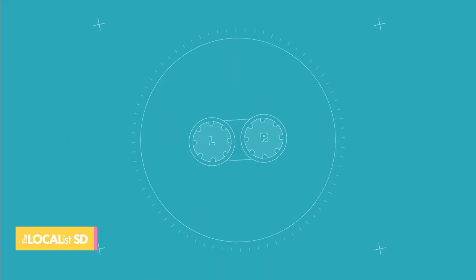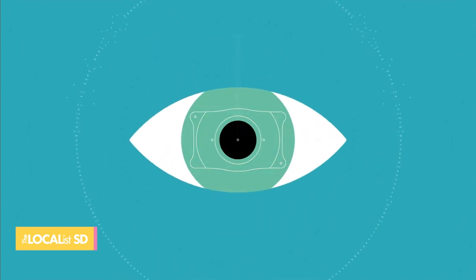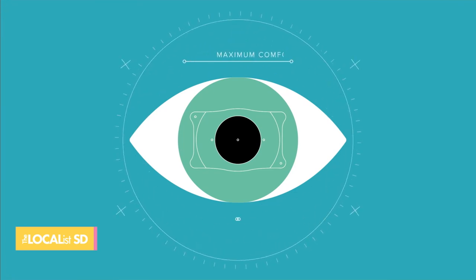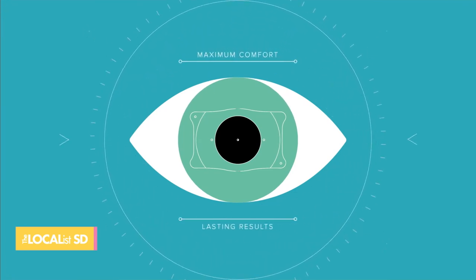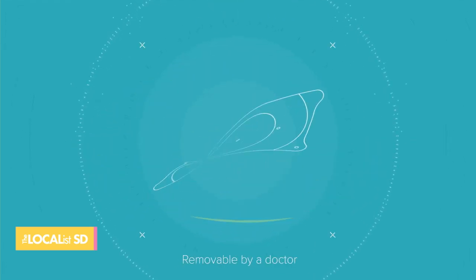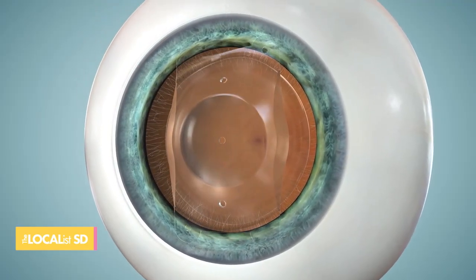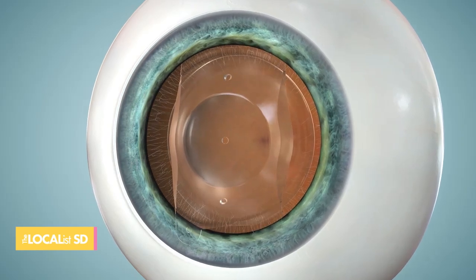It's good for patients the age of 21 to 45. And being a LASIK alternative, instead of removing tissue from the eye, you're actually adding this lens inside the eye, and it's removable. So people that are fearful of a flap or may have dry eyes may be a good candidate for the EVO ICL.